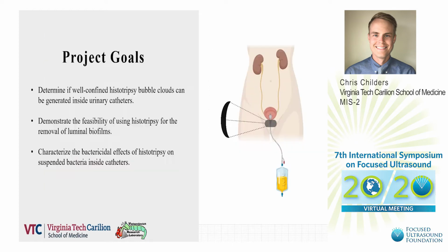The goals of this project are to determine if well-confined histotripsy bubble clouds can be generated inside urinary catheters, to demonstrate the feasibility of using histotripsy for the removal of luminal biofilms, and finally to characterize the bactericidal effects of histotripsy on suspended bacteria inside catheters.